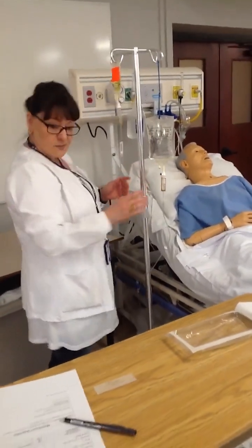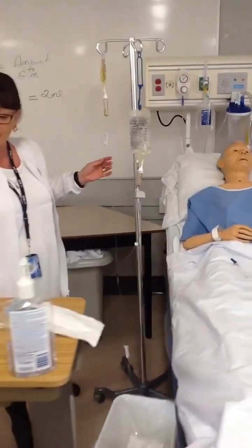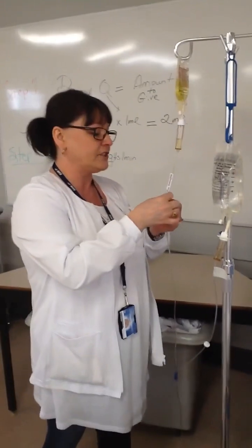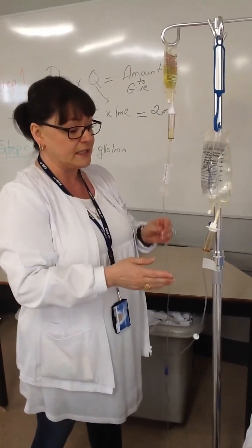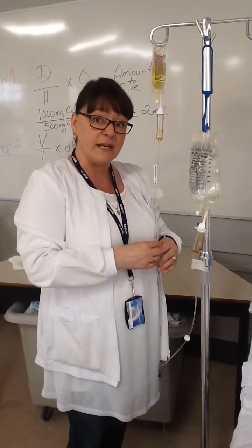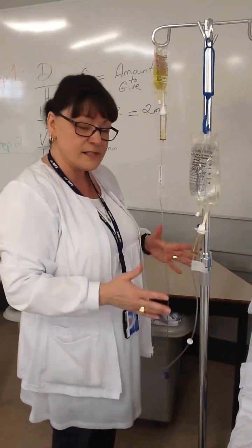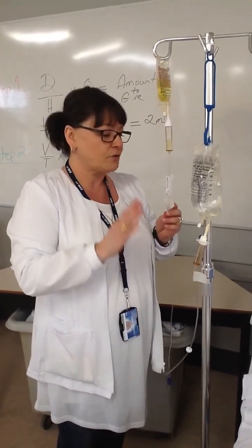Okay, and if I didn't explain well enough in the beginning, let me just go ahead and explain that again. I'm applying the piece of tape that has the date and time that I initiated this tubing. If an infusion tubing is continuous, it's good for 96 hours or whatever agency policy dictates. If it's an intermittent infusion, so that means I'm disconnecting it from any part of its closed system, it's only good for 24 hours, and according to agency policy. And when in doubt, throw it out.